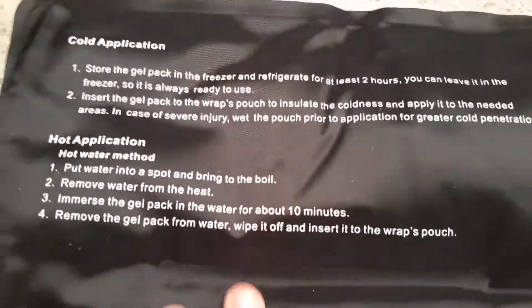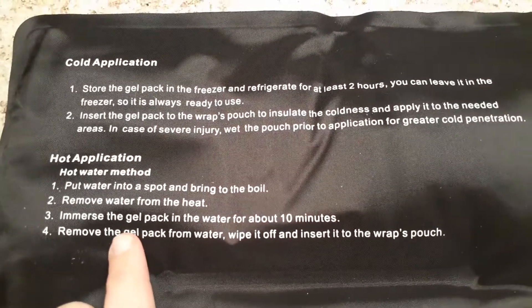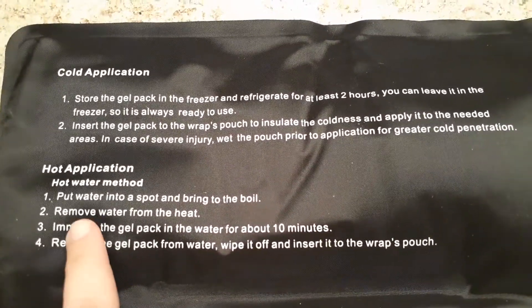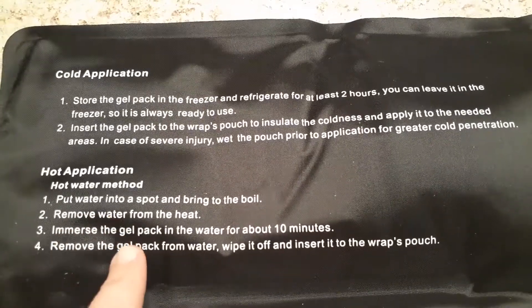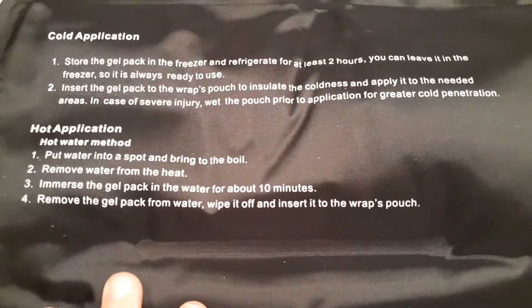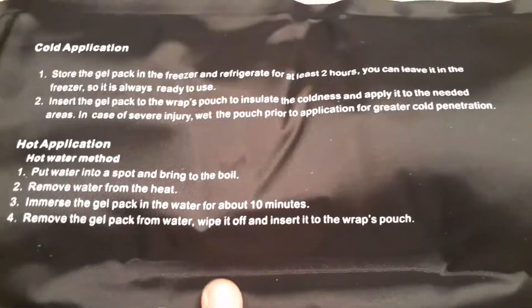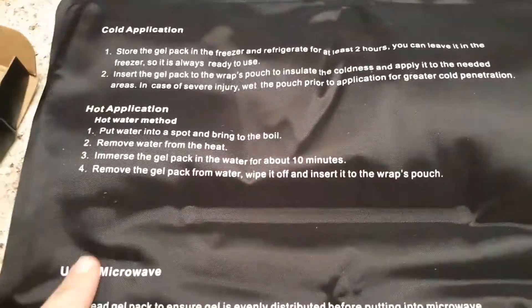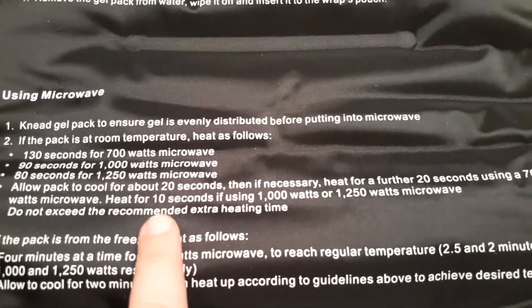Here are the instructions — you can pause the video if you want to read through that. It says you can even use hot application: just put it in boiling water and immerse the gel pack for about 10 minutes. So you can use it cold or hot. You can also put it in a microwave for about 20 seconds.